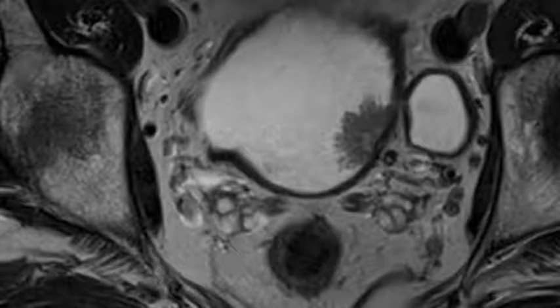The multiplanar capability of MR imaging allows image acquisition in different planes to minimize partial volume averaging and optimize imaging when evaluating the depth of bladder wall invasion. Coronal images are used for delineating tumors located in the lateral bladder wall and dome, whereas sagittal images better depict lesions of the anterior and posterior wall and dome.